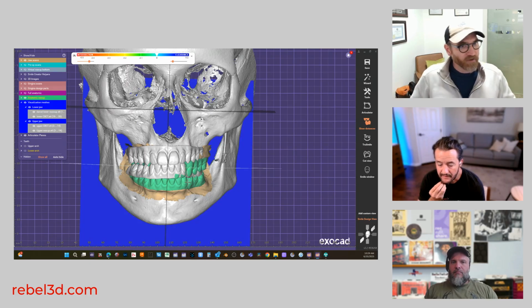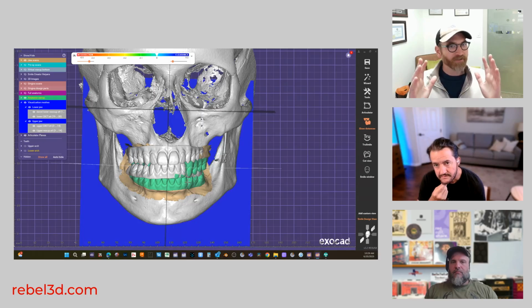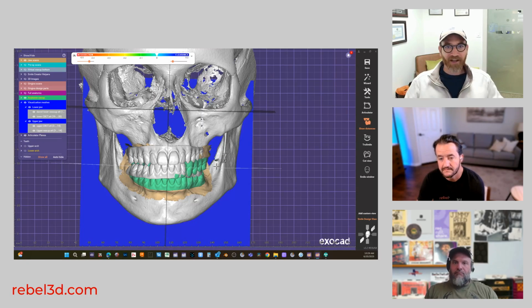And facial scanners don't provide you as precise information, I feel, as 2D photos. I can absolutely set a 2D photo up accurately, so I feel like I'm looking at it properly.